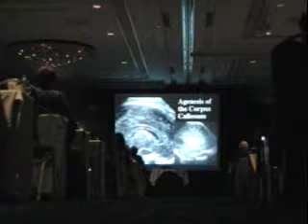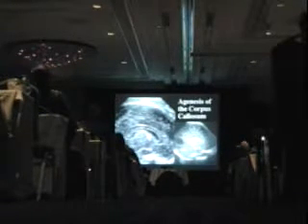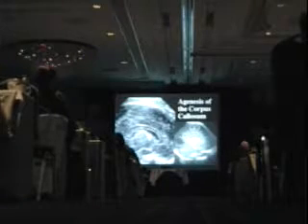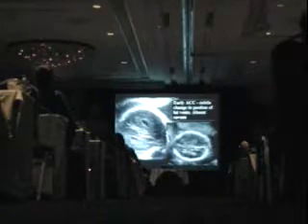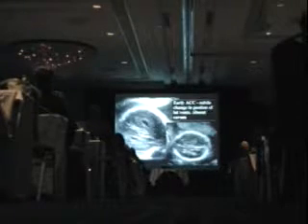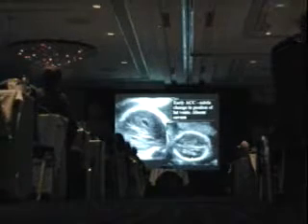And take a look, find the corpus callosum or the lack thereof, even if you have to do a transvaginal scan and get right on top of the fontanelle to show it to you. Even if you don't do a vaginal scan, you can suspect agenesis of the corpus callosum. It is a very subtle abnormality early on.